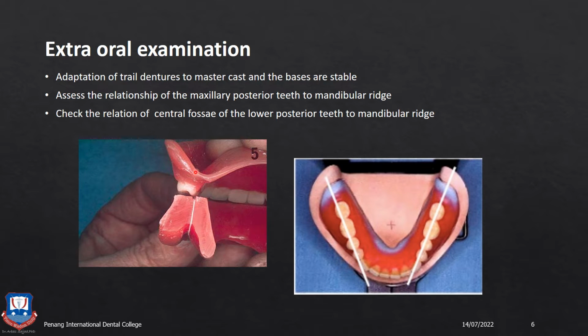Extraorally, you examine the denture flanges for fullness, and you examine the finishing of the wax setup of the denture teeth. There should be no wax on the teeth. It should resemble a final setup that needs to be acrylized and finished.